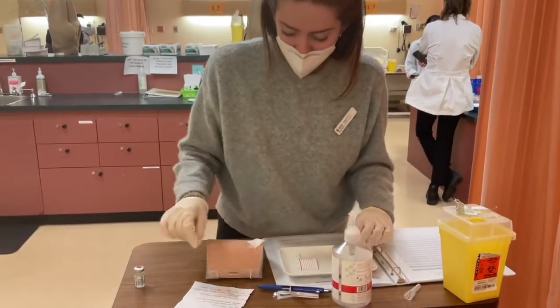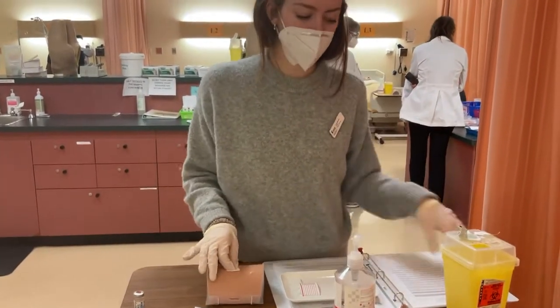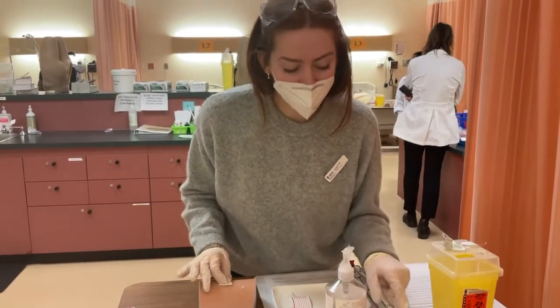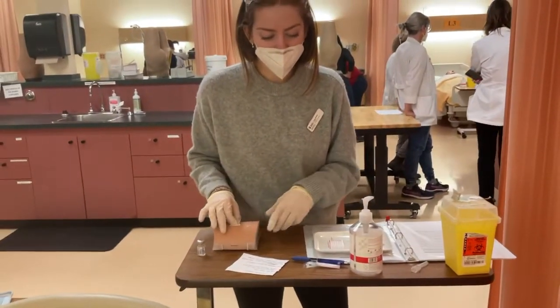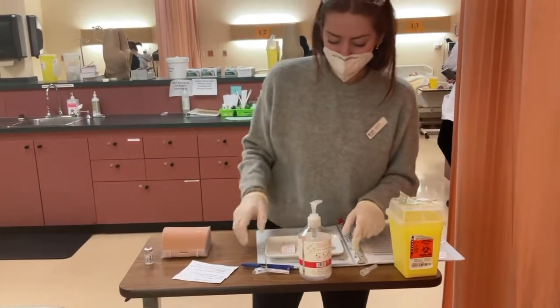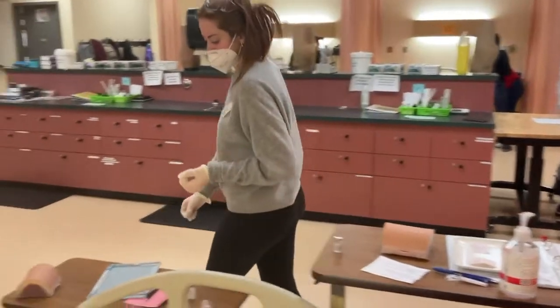And I will put a cotton ball over the site just to apply a little bit of pressure, make sure there's no leakage or bleeding. Okay, that is all good. I will ask the patient.